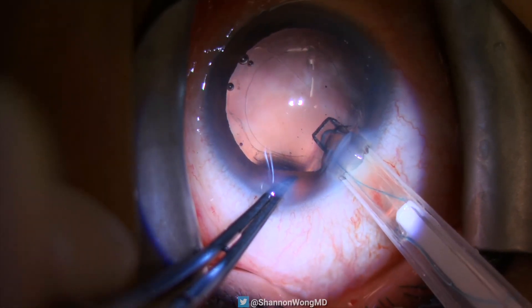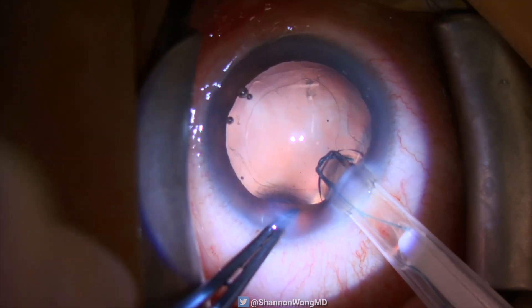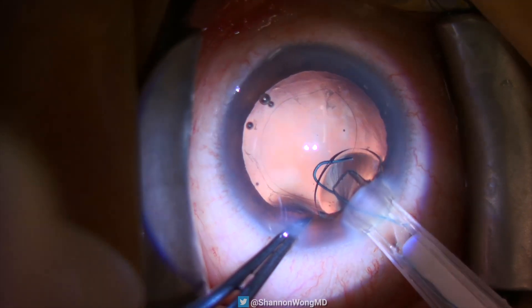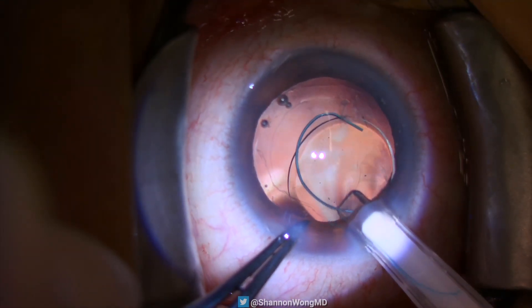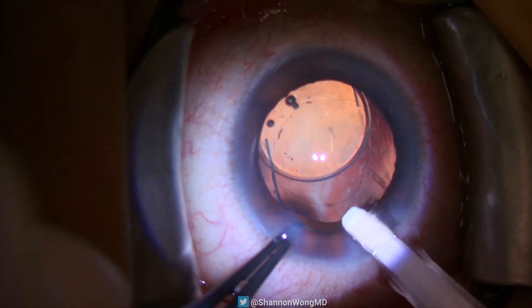There is, however, on occasion, an issue where the haptics might be bent during insertion of the lens. In this case, the leading haptic is trapped between the optic and the injector, causing the leading haptic to be bent. If we place the lens into the capsular bag with a bent haptic, the lens will be decentered.